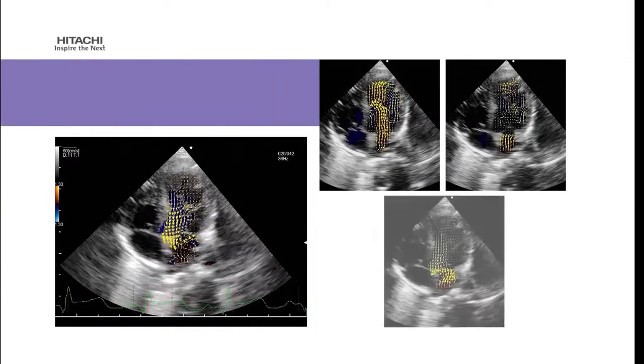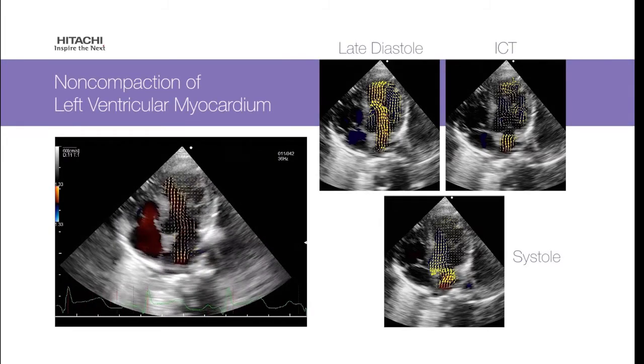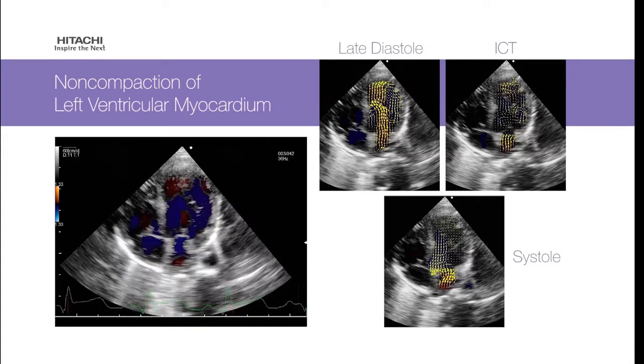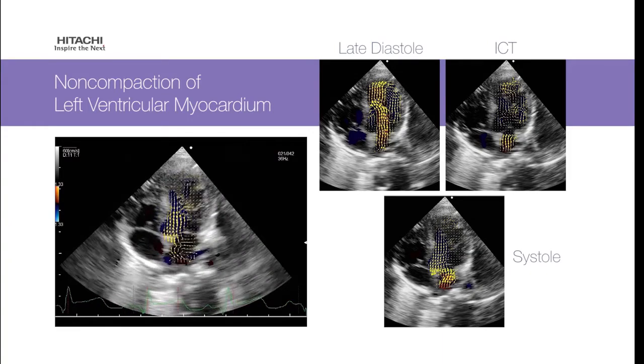Non-compaction cardiomyopathy is a rare congenital cardiomyopathy. VFM enables assessment of intraventricular flow efficiency and may be able to evaluate the severity of non-compaction of LV myocardium.